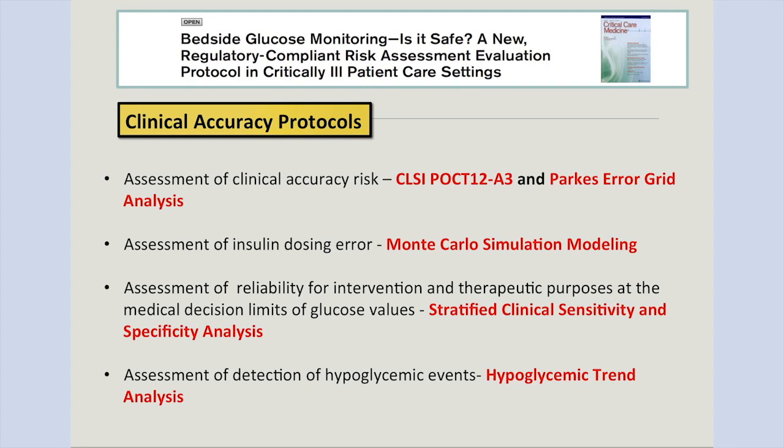to them." What we need to do is be able to say what is the clinical risk of using this device in a particular population. So we had to come up with a way, and we were creative and figured this out from scratch, and oh my goodness, but we weren't. We applied other people's very creative thoughts. So what did we do?